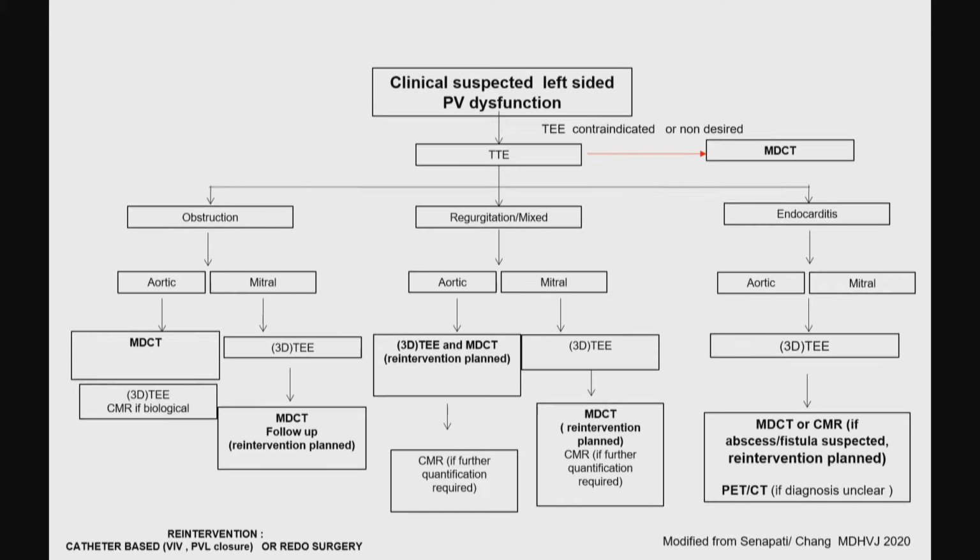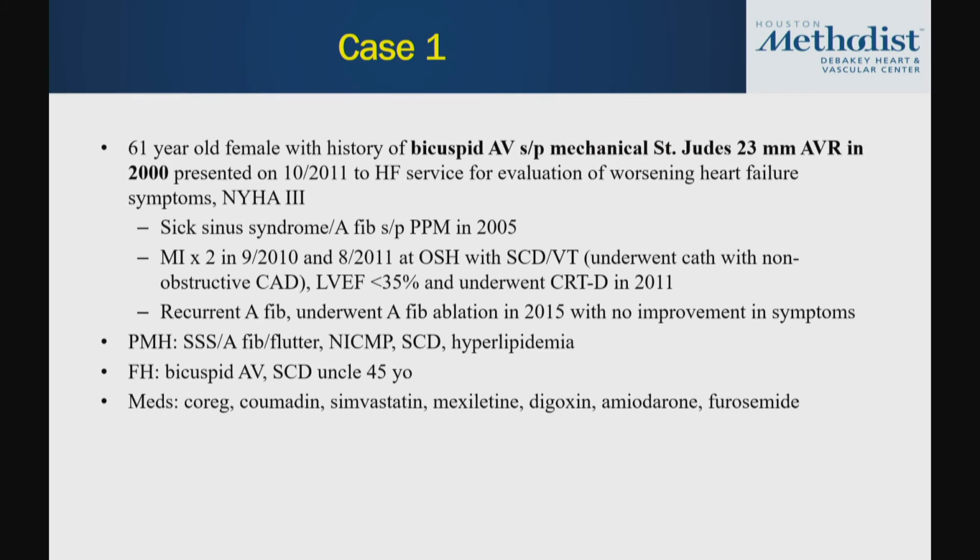And because of the current pandemic, if TEE is contraindicated or not desired in a patient with suspected infection, multi-detector CT could be quite useful in supplanting TEE. We're going to show you some quick examples. I'm going to run through some quick cases.